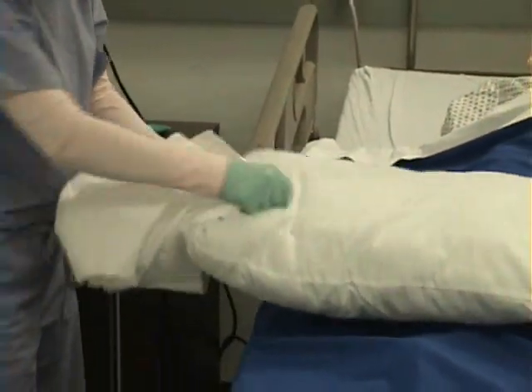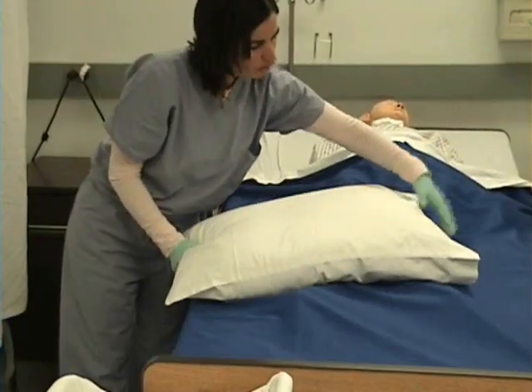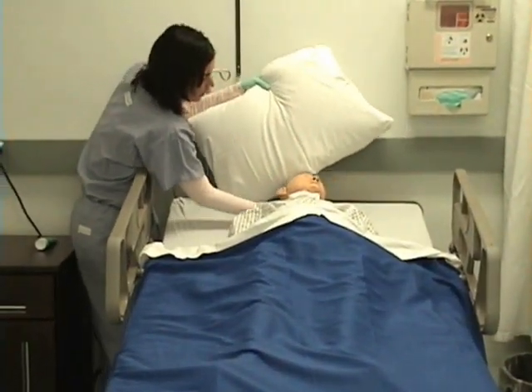you can grab the end of the pillow and put the pillowcase on. I will place the pillow supporting my patient's head and neck, gently.